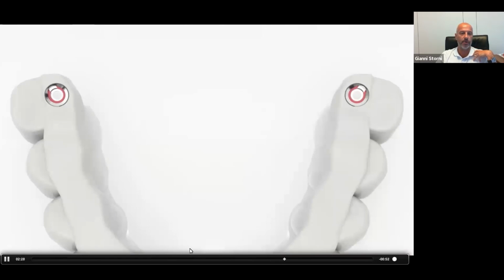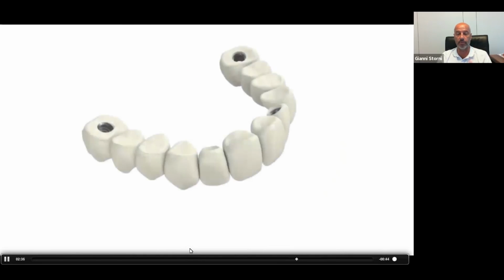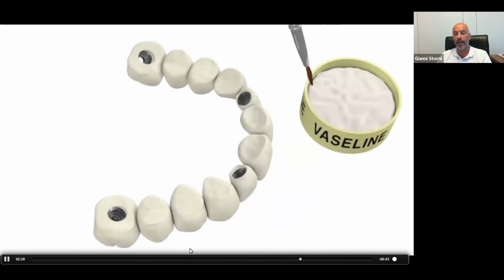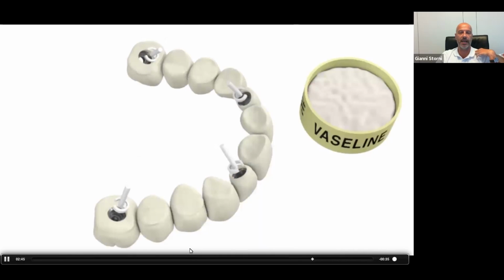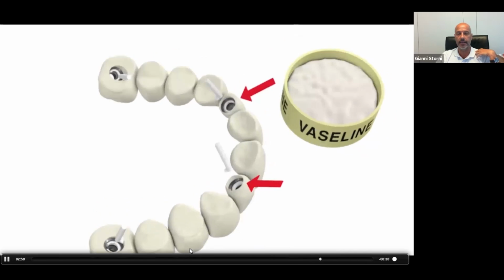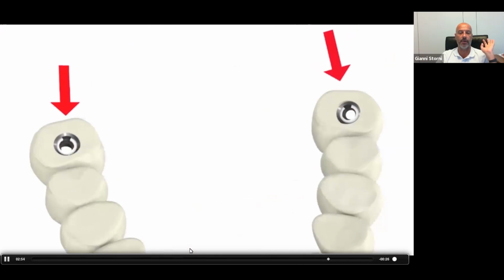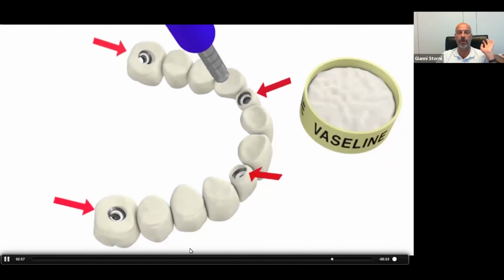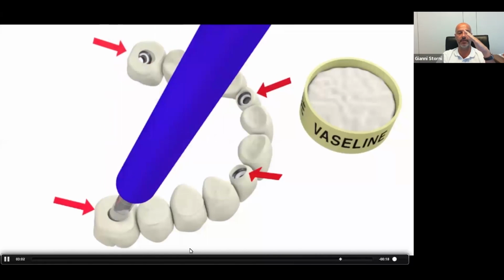You see that they are rotated in the correct way, in the maximum equator. The pink ones are the provisional Seegers, and now, before the end, we can use a little drop of Vaseline to help the Seeger click in correctly. Then they click, they break, and they are ready. You see, they are rotated in the right direction, open area where we have the maximum undercut.